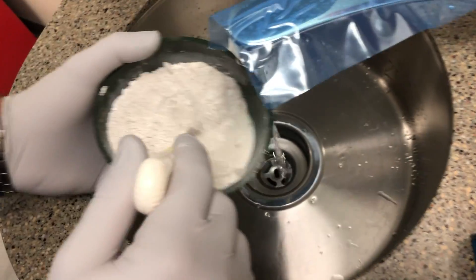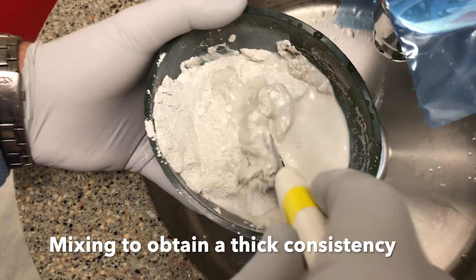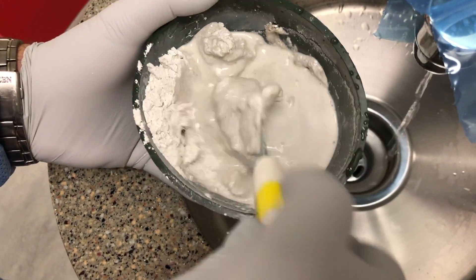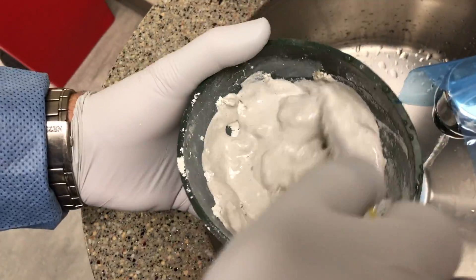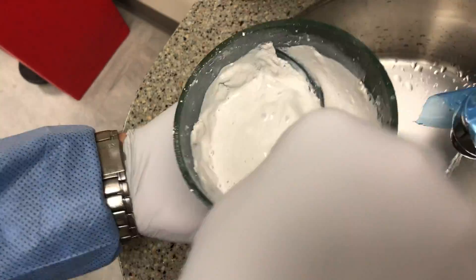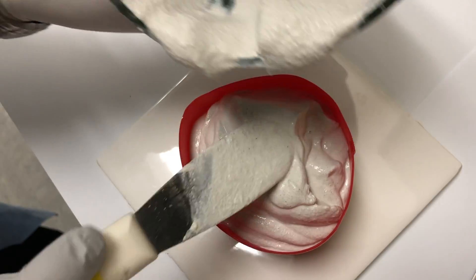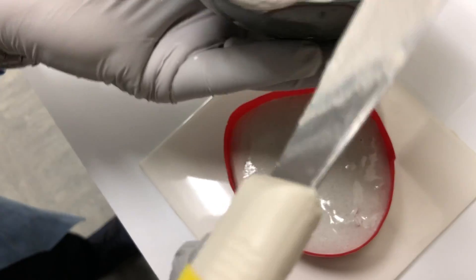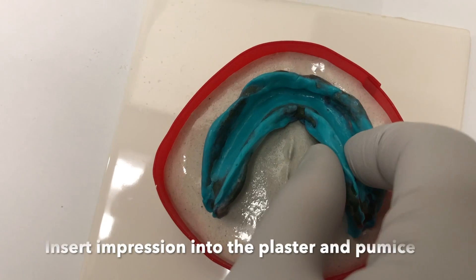Start adding water and mixing it with the powder to obtain a thick mix. Pour the mixture into the former and spread it evenly. Place your impression in the plaster and pumice mixture.